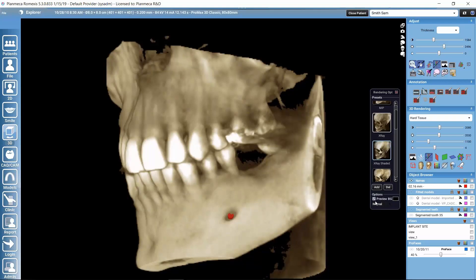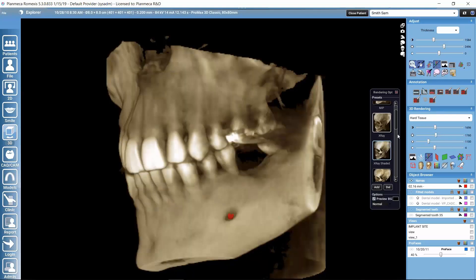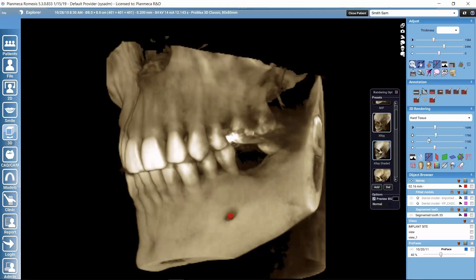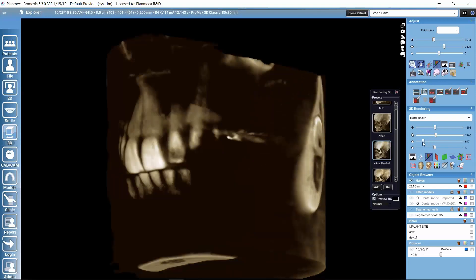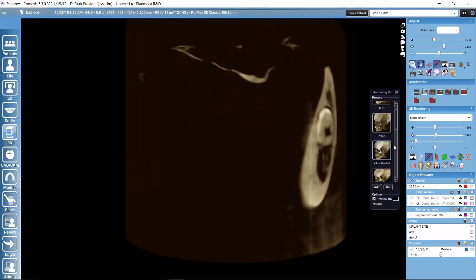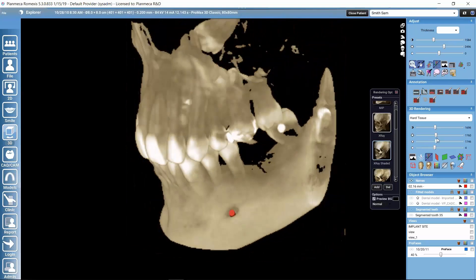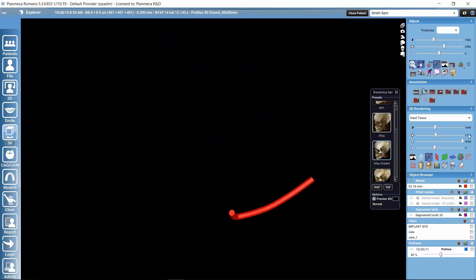The rendered view can also be adjusted from the toolbar under 3D rendering, which has sliders for contrast, brightness, volume transparency, and a threshold slider. The threshold slider adjusts which densities are displayed — moving it to the left shows all captured data including soft tissue, while moving it to the right removes softer tissues until only harder ones remain. Moving it all the way hides all the data, leaving only objects like the nerve visible.